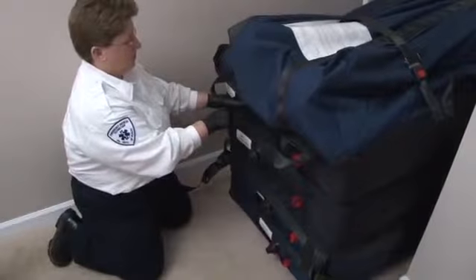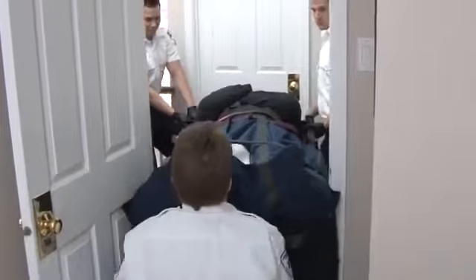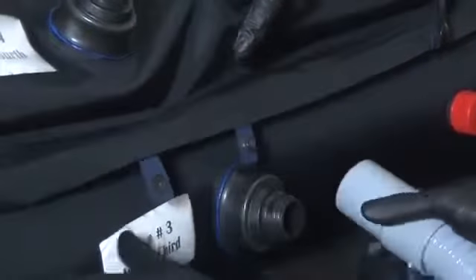In order to navigate narrow doorways or sharp corners, crew members may bleed air from each of the 4 chambers by depressing the black one-way valves. This will soften the chamber slightly to accommodate tight spaces. Reinflate the chambers after you have cleared the narrow space to ensure maximum stability while transporting.